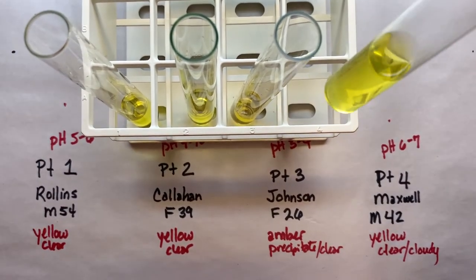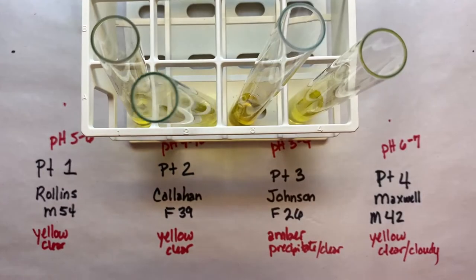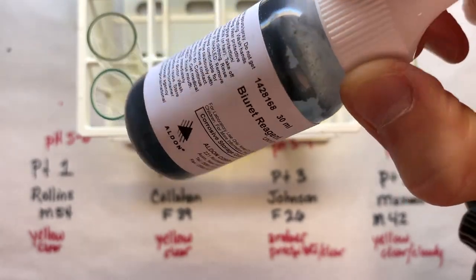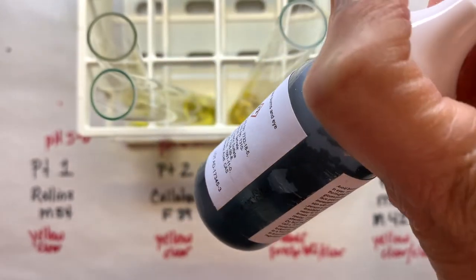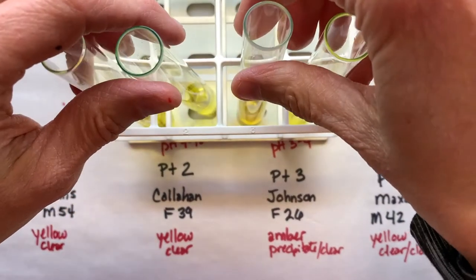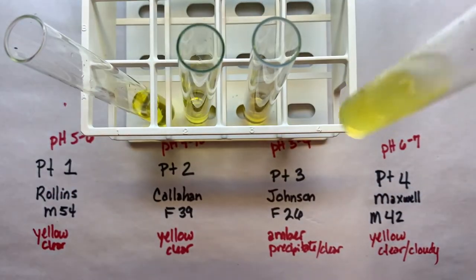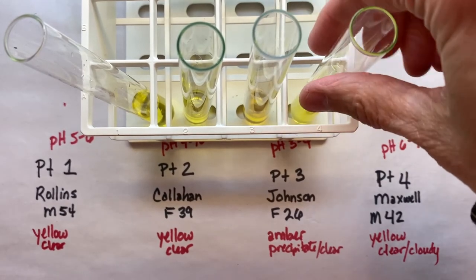So as I feared, this Biuret is not good. It is not shelf stable, and so you can see that the portion which lends it color, the copper, has probably precipitated out, and now it's stuck to the inside of the bottle. So we're not going to get anything off of this one, and I'll have to do it again. Let's see what's happening here. Anything's going on. I do see some change, so maybe that's good.